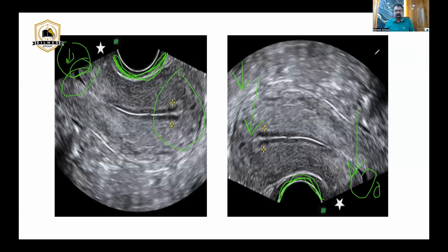I hope that I have replied to the question. In the Indian subcontinent, we don't invert the image, but in Western countries, in some cities, they do, because those taking the ultrasound pictures are sonographers, and the radiologists interpret the image. So it depends on the demand of the radiologist whether to keep it this way or that way.